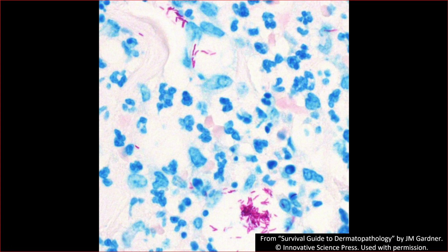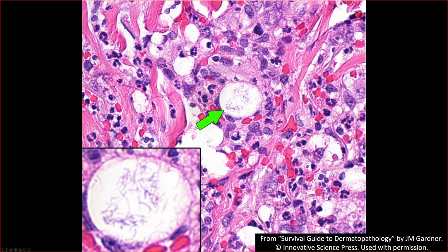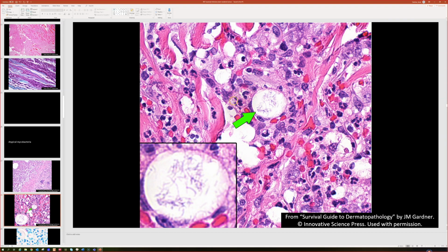So this case, that patient right here was immunocompromised, I remember. And he didn't actually have much granuloma, just neutrophil abscesses. You usually think of granulomas for mycobacteria, which you do usually have with or without neutrophils. But sometimes you will actually not have much granuloma if you don't have good cell-mediated immunity. I think this grew out Mycobacterium kansasii, if I recall, but it's been a long time ago, so I might be wrong about that. All right.